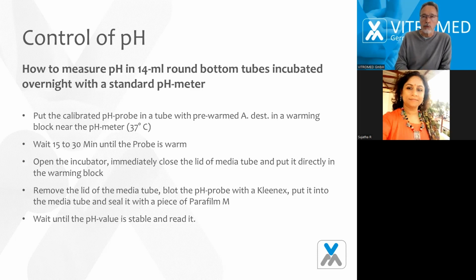This is why you need this warming block. You can put the probe in a tube with distilled water during the change of the samples, and so you can always be sure that more or less you have a warm measurement.